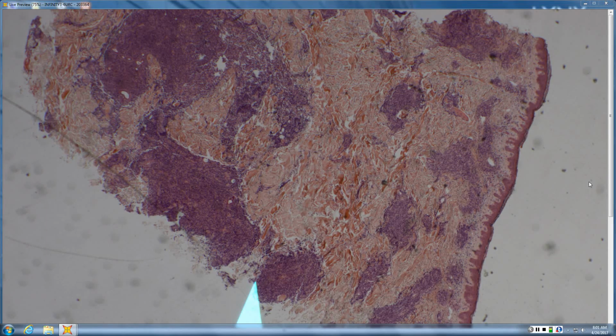Let's start that over again. So follicle center markers BCL6, CD10 would usually be negative in a marginal zone lymphoma unless there are benign germinal centers there. One of the common patterns for marginal zone lymphoma is to have big round germinal centers and then all this gray stuff spread out between them. That's the lymphoma. The germinal centers themselves are benign.